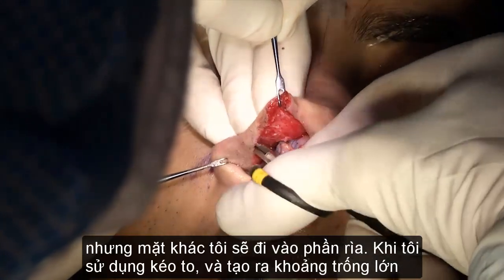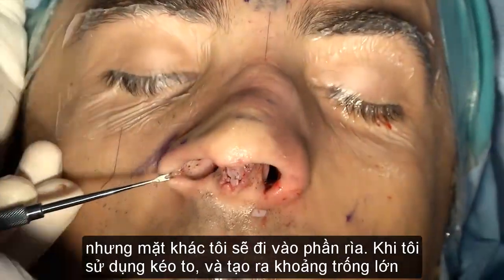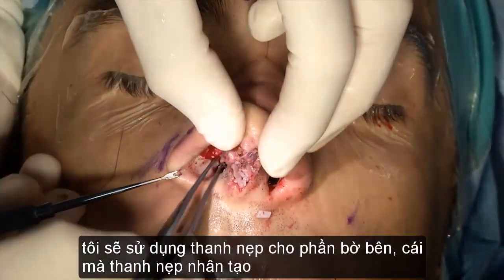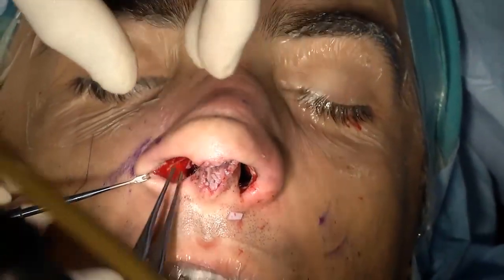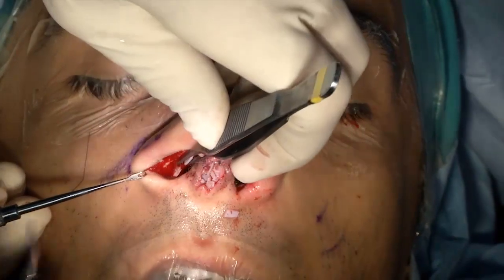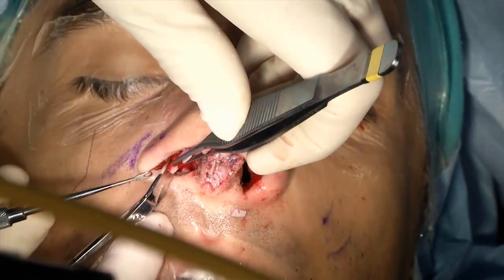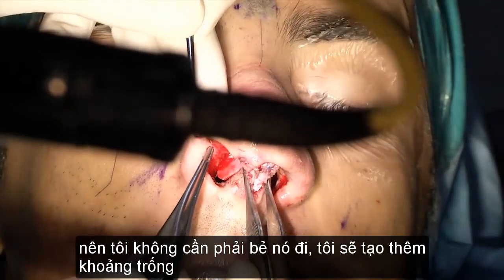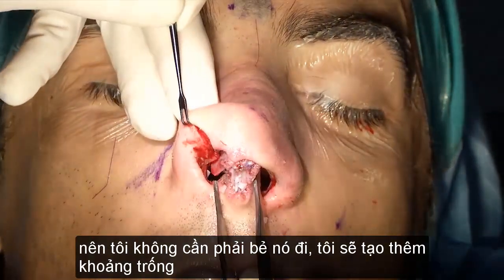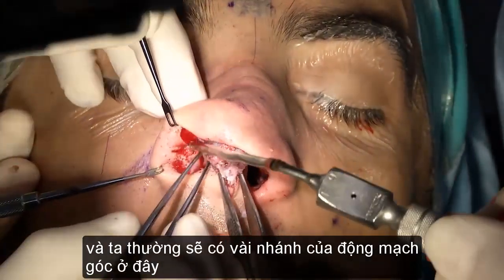But I'm getting to the rim anyway. And since I'm using kind of big scissors and I have a big space, I will use splints for the sidewall, which are little plastic splints at the end of the case. I don't want to break it, I need to increase this. And then there's branches of the angular artery here, usually.